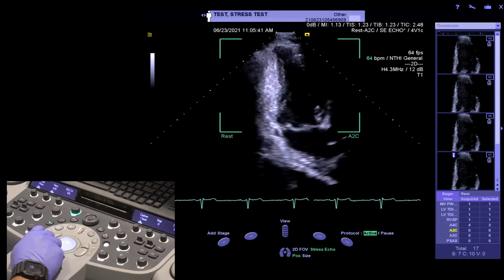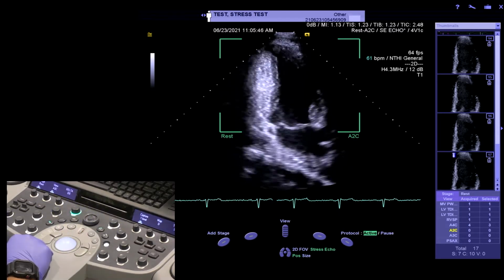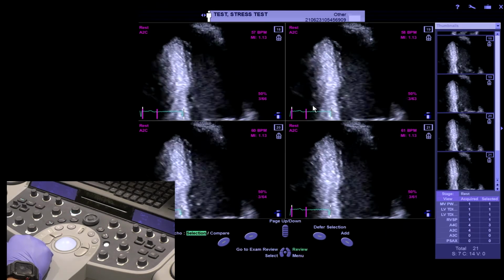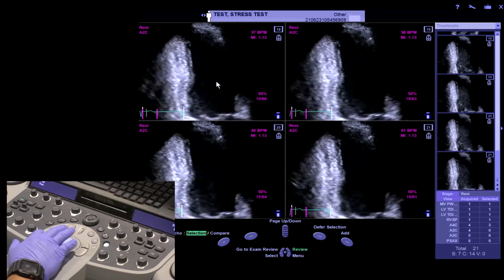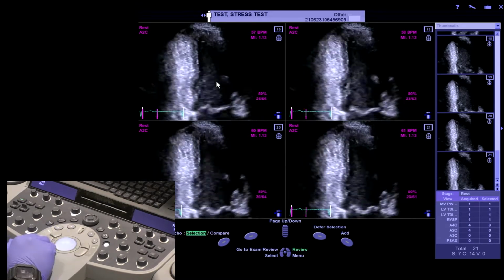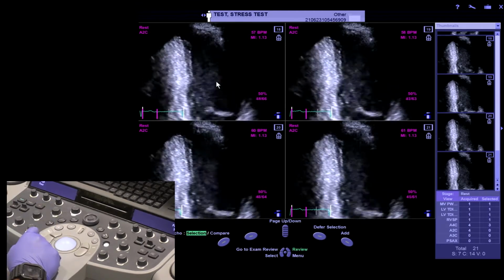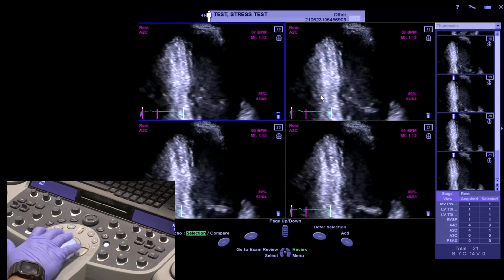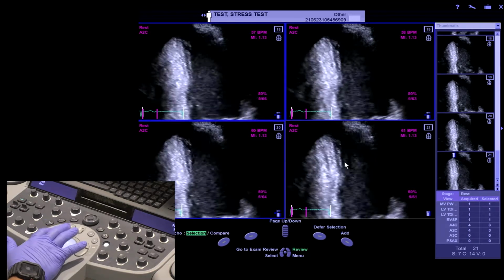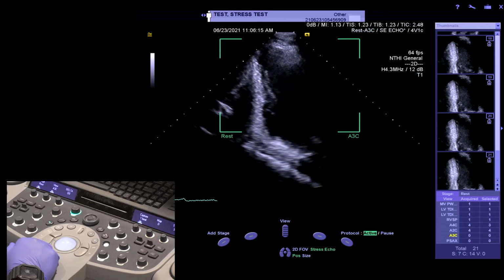Patient, take a tiny breath in, hold, and then acquire a live image. You may breathe, and we will then, just as before, if we only liked one image, we would double click on said one image. If we liked none of the images, we would hit 2D and defer back to reacquire. Or if we liked all of the images, we would simply select all of them, with the last image being a double click. Resting 3-chamber.